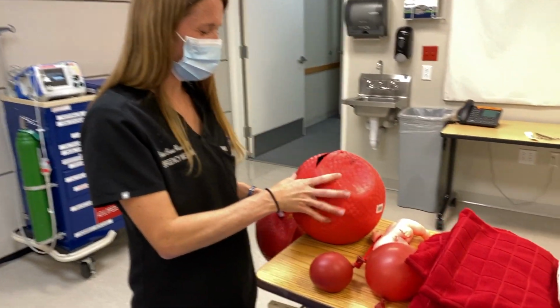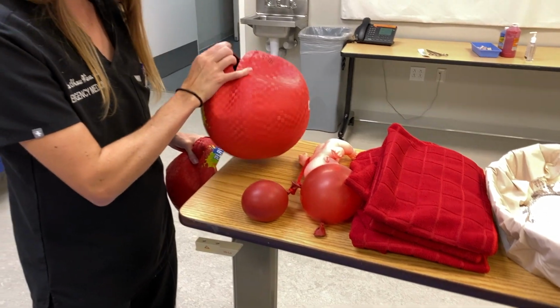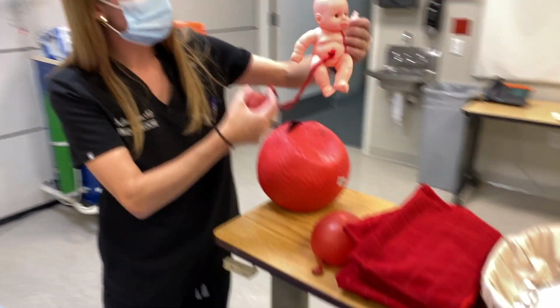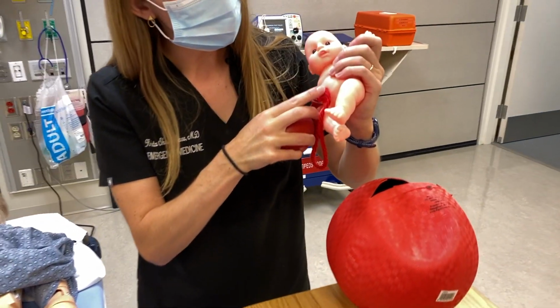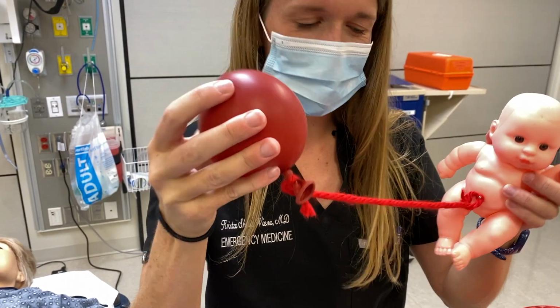Okay, so this is our uterus. It's just a dodgeball that I cut a hole into. And then for baby, a little baby doll, and then I put a nail into his belly to attach a cord, and then a balloon for the placenta.